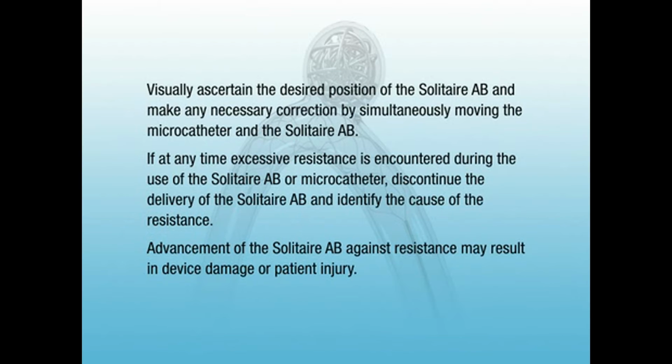If at any time excessive resistance is encountered during the use of the Solitaire AB or microcatheter, discontinue the delivery of the Solitaire AB and identify the cause of the resistance. Advancement of the Solitaire AB against resistance may result in device damage or patient injury.